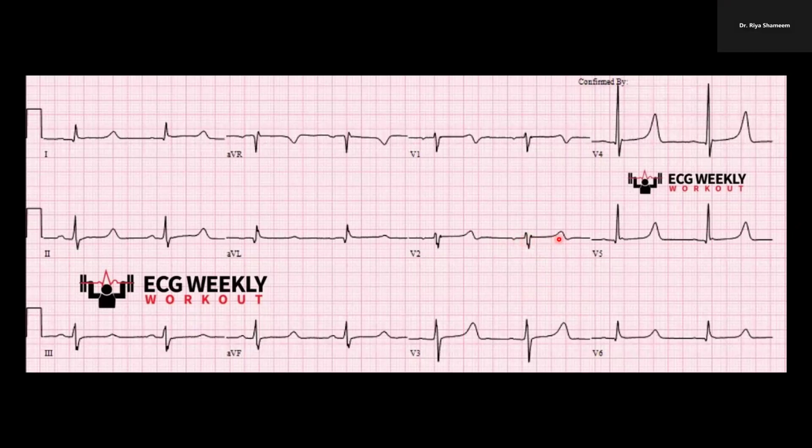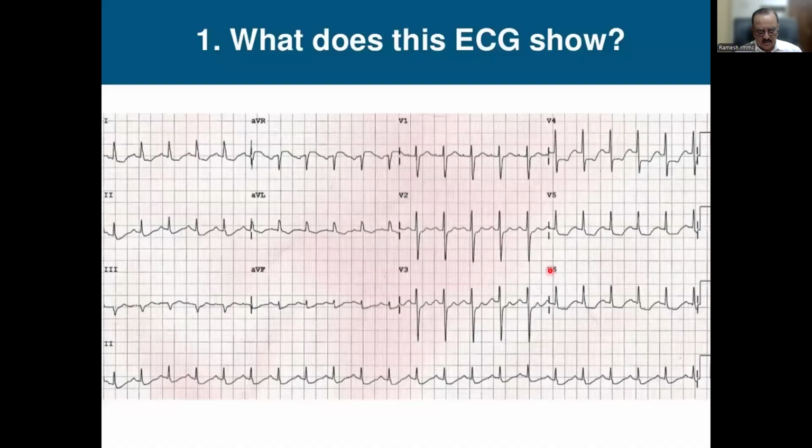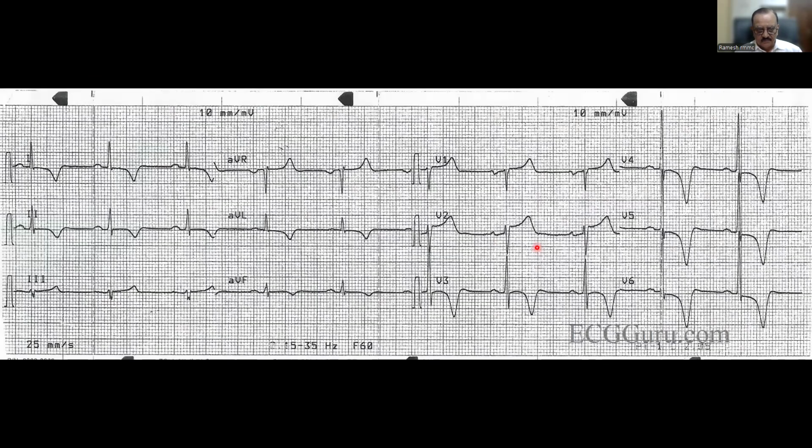Sir, the gray ECG, the previous one. I'm seeing the pink ECG. This is ST depression, definitely. Is that significant, sir? Yes, definitely. It is an acute event, an emergency to be admitted. No doubt. Any ST depression is definitely an emergency. Okay, sir. Thank you, sir.